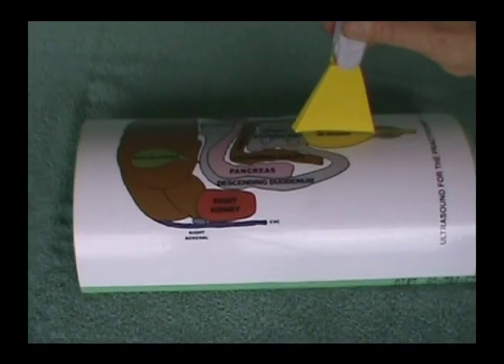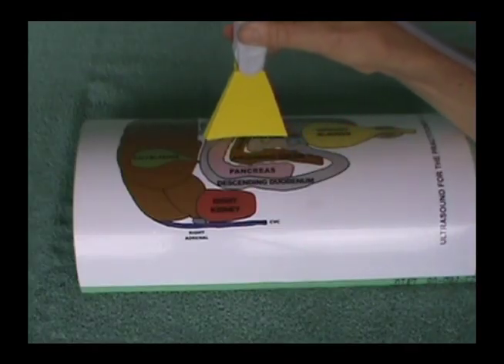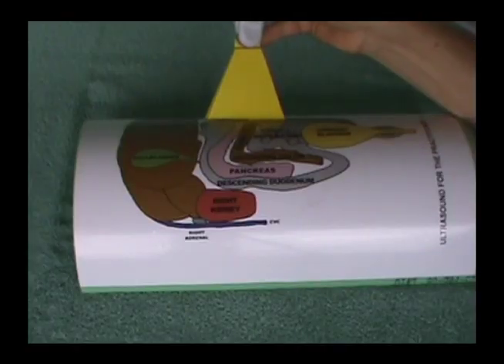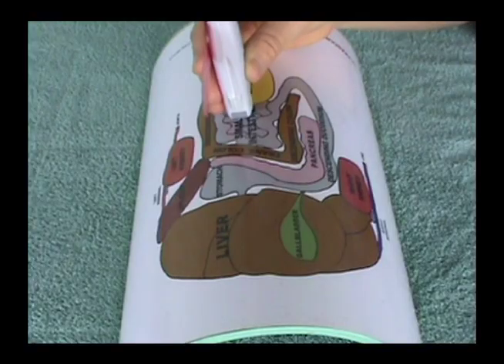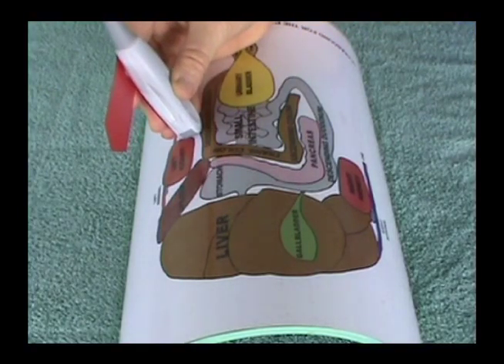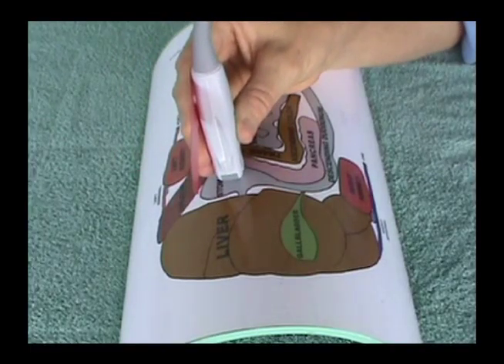In this form of movement, the transducer's point of contact with the patient's body changes without breaking contact with the skin. Use the abdominal graphic included with this DVD to copy my movements. Begin at the stomach with the transducer in the sagittal plane.